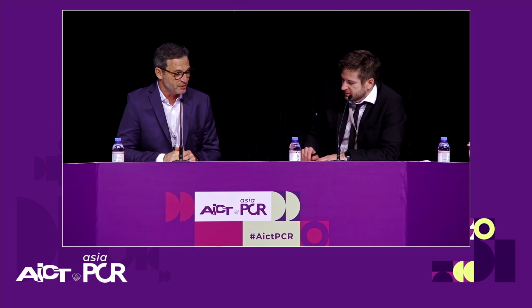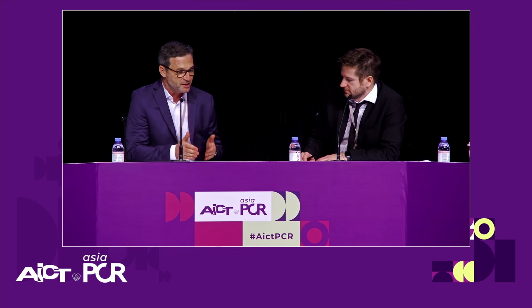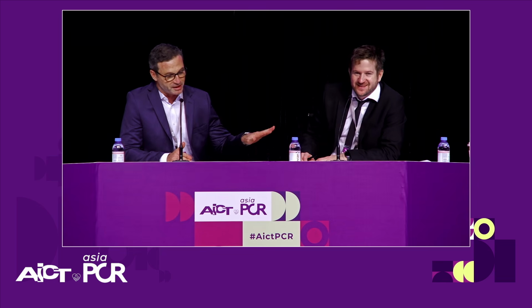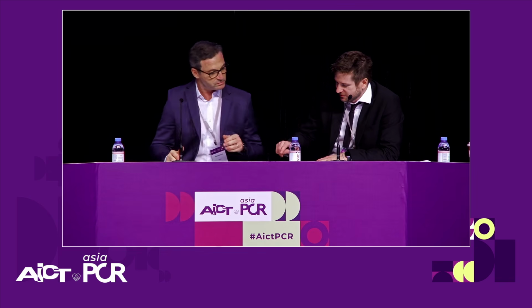So then, for instance, balloon testing could be a good approach. You can, if you're not completely sure, between the shockwave use and the stent implantation, if you're not using DCB only, because sometimes you use DCB only. It's another discussion that we might have at the end. I think it's a very good combination, DCB only after Shockwave. But if you're going to stent, you can test with a cutting balloon or a regular non-compliant balloon and see if it's fully expanded.